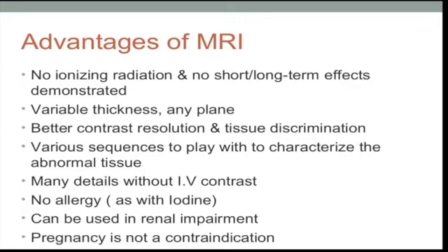So there are no ionizing radiations, and usually you can get a lot from an MRI without a contrast. Yes, you will have to rely on contrast in many situations, but you won't need as much contrast as you would in a CT, or not in as many situations as you would in a CT.